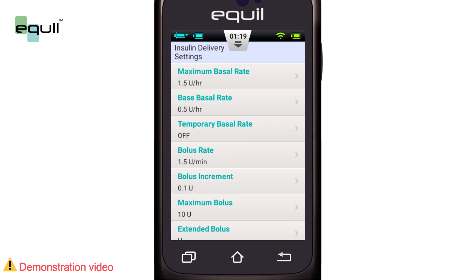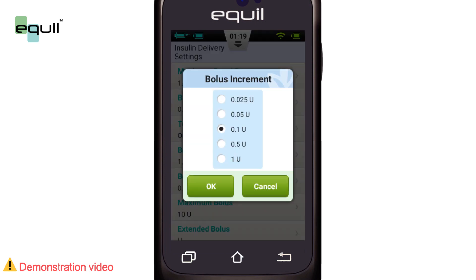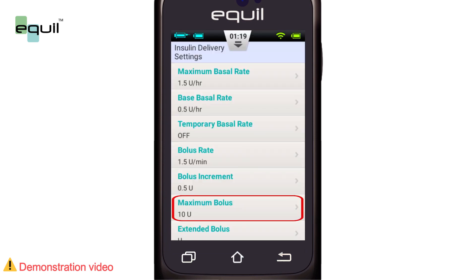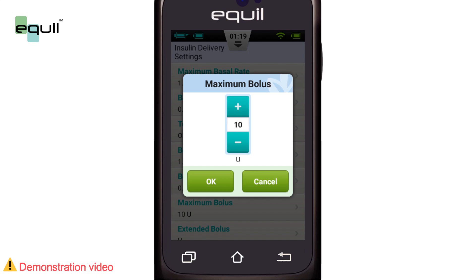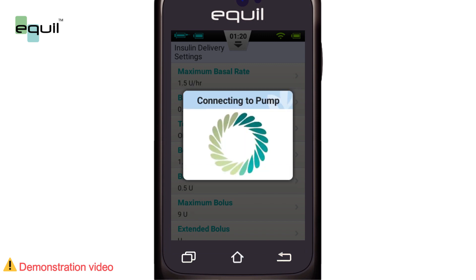The Bolus Increment Setting is the amount that the requested bolus changes when pressing the plus or minus button. The Maximum Bolus Setting is the maximum bolus dose that the pump can administer at once. This feature is used to reduce the possibility of overdose due to error.